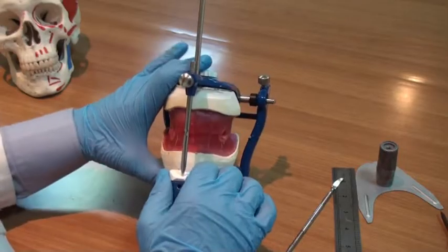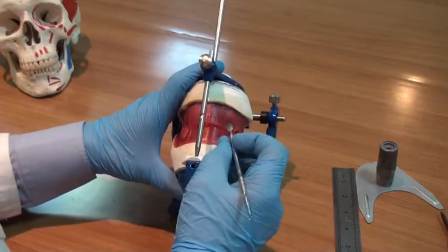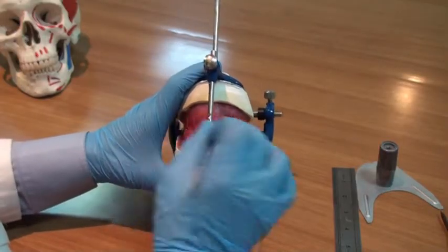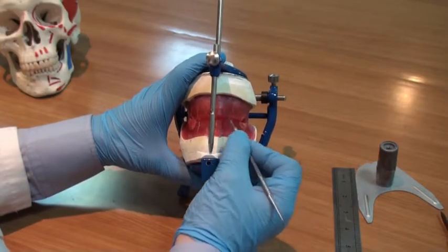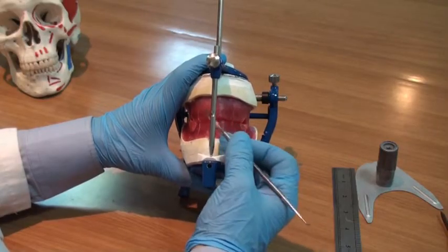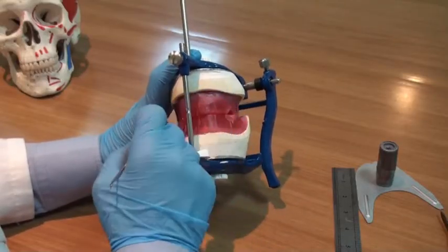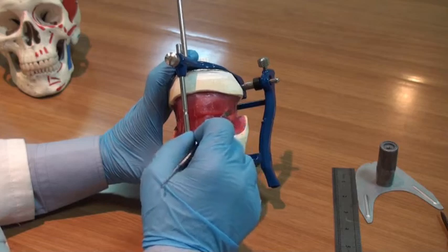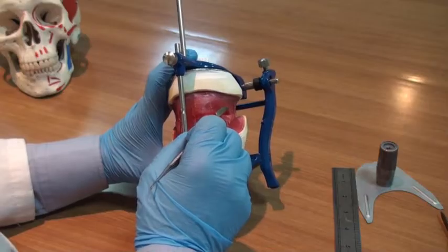Now, the third determinant registered in the wax rim is the labial and buccal contour of the upper or maxillary wax rims. The labial contour of the maxillary wax rim will provide us with the proper lip support inside the patient's mouth, and the buccal contour of the upper wax rim will provide us with the proper buccal corridor inside the patient's mouth.